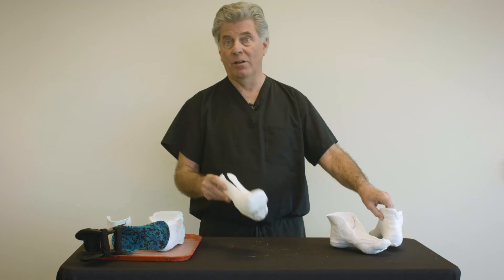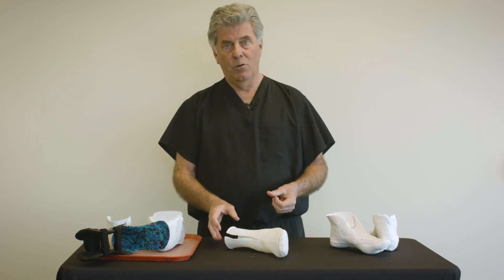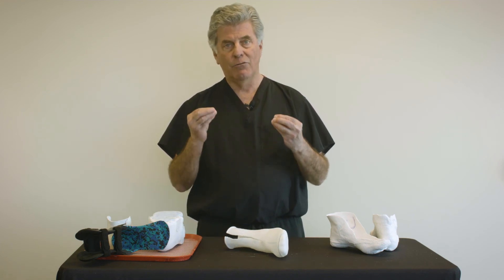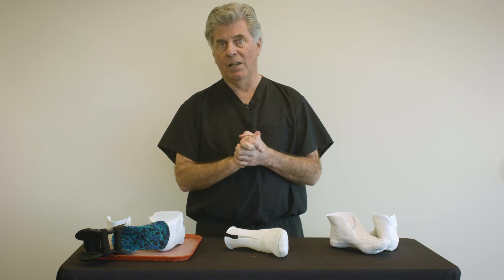The best option of all is using our new digital casting system, which allows accurate capture of the anatomy and greatly reduces the chance of error in distorting that cast and sending the data to the lab.